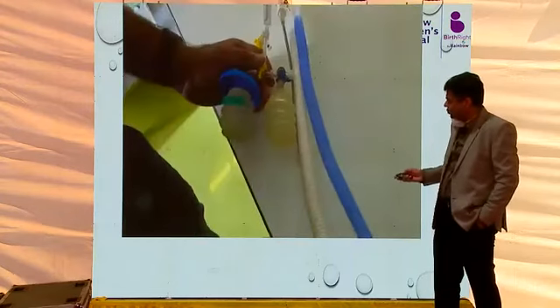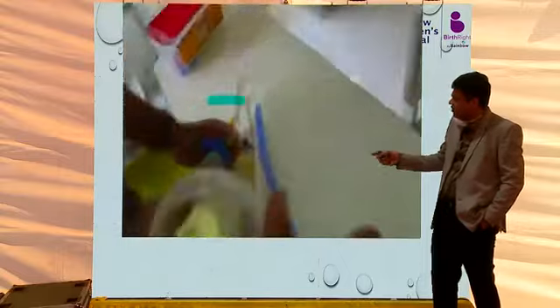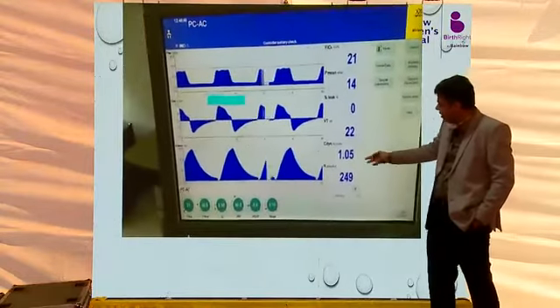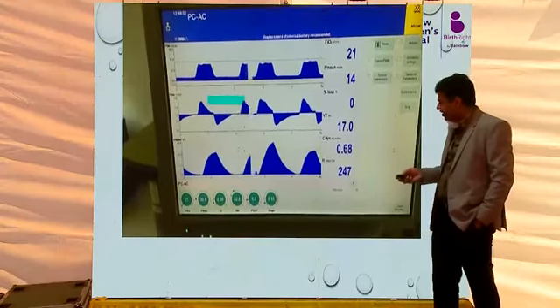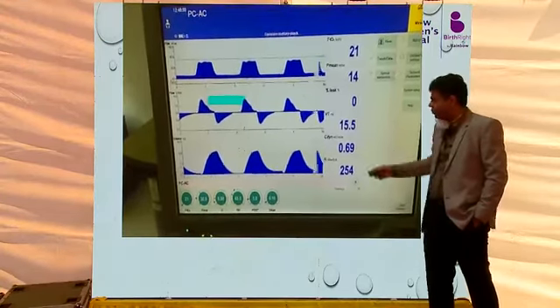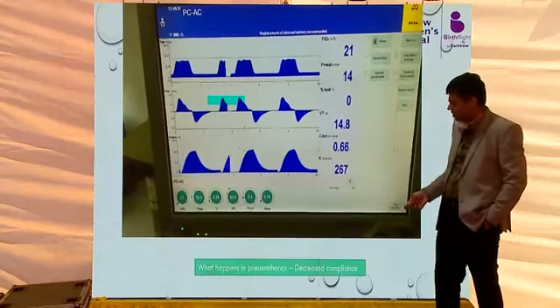You don't repeatedly prick the baby at one particular time. So this one is a single lung ventilation baby. When both lungs are ventilating, the compliance is good. Non-invasive tools, like transcutaneous monitoring and the compliance, help when assessing single lung ventilation. So we will discuss this more in the workstation, sir.